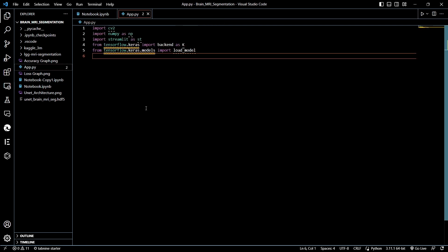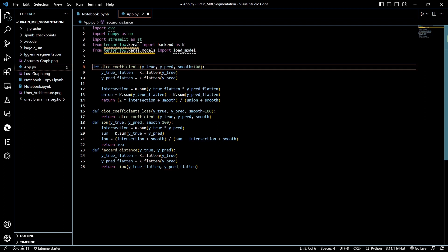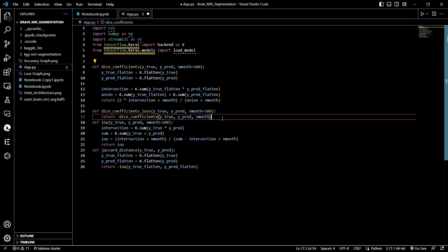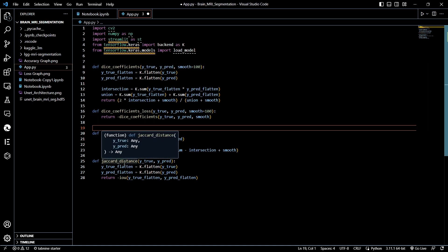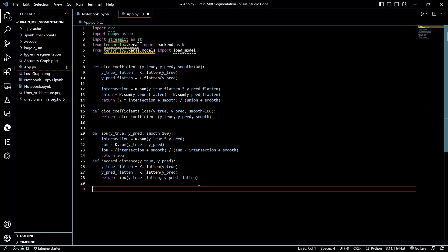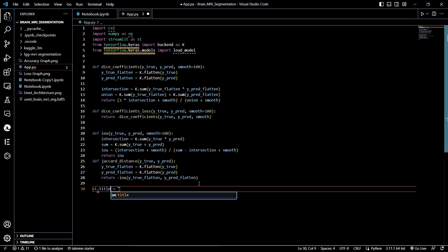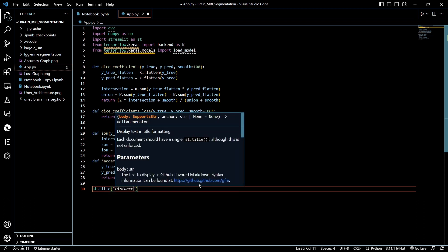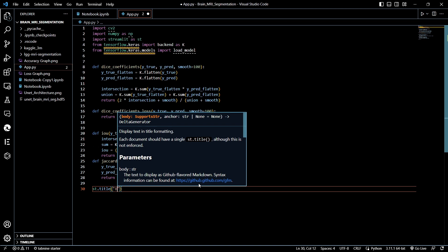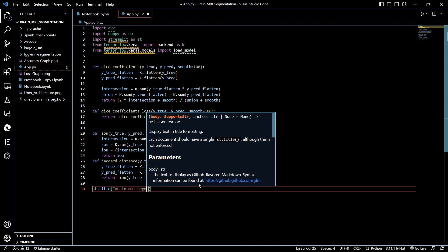We now have our dice coefficients, dice loss, IoU, and Jaccard distance as well. Now let's start the front-end coding. Streamlit has many parameters and functions — st.title() is used for setting the title, and we are going to set it to 'Brain MRI Segmentation App'.